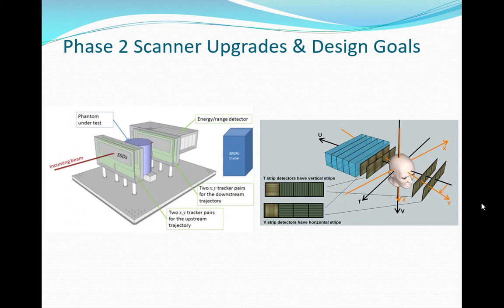Typically, when one of these sees a tiny voltage on one of its input lines that's enough to be different, it'll signal everybody else. If front and backside both see a spike, we go at 1 all the way through, yay, on these detectors, and then we read the readout. The light does drop off over time, so pulses overlap each other. There's a chance for error. We'd ideally like the energy to drop off faster, but you also need to get a good amount of light. Trade-offs. So, do we have proton gun technology that's able to put out 1 proton at a time?